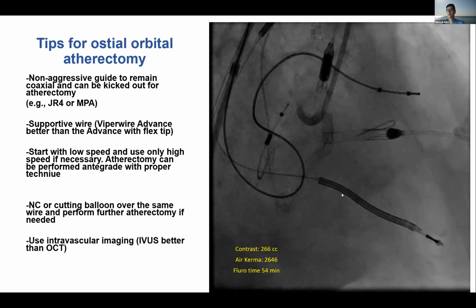The other problem here is, especially if you have a calcific nodule or very eccentric calcium, and you go very, very high at high pressure and a large balloon, that's when you may actually perforate the vessel. And we saw some pretty dramatic perforations from Lindsey's presentation earlier on. So keep in mind that how aggressive you are depends also on the vessel. In those very calcified vessels, it might be better to go with a slightly under-expanded balloon and even accept a slightly imperfect lumen. Maybe you are not 7 millimeters square, but you are 6 millimeters square. That might be enough, rather than going very aggressive and potentially risking a complication such as perforation in those lesions.